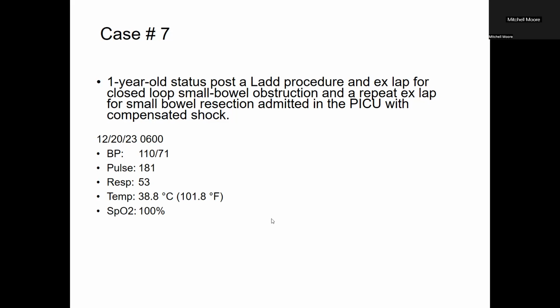I had a quick question, Vidit. Thanks so much for doing this. Clinically at the bedside, I sometimes see absence of lung sliding with a patient that has a clinical reason or a chest X-ray that's consistent with pneumothorax, and I'm trying to dynamically enter the pleural space without injuring the lung parenchyma.